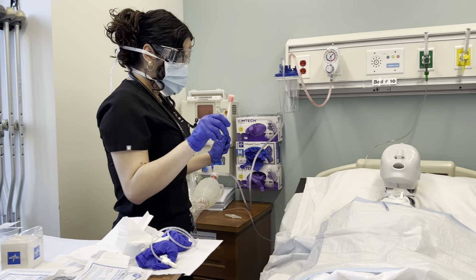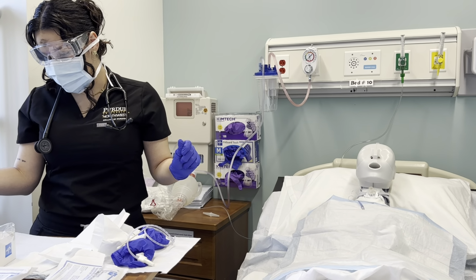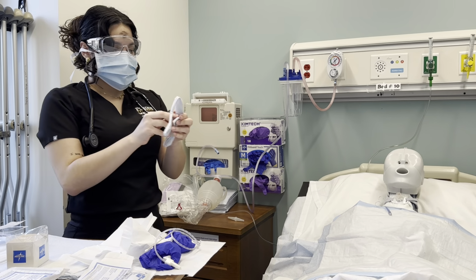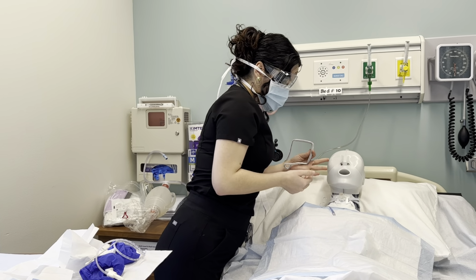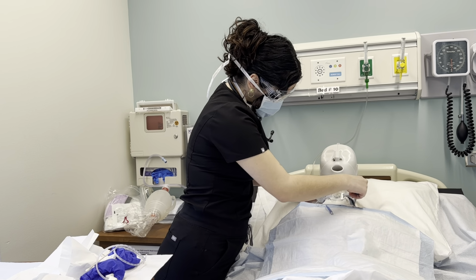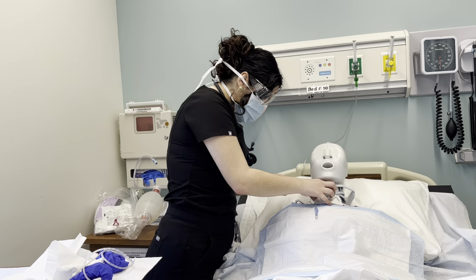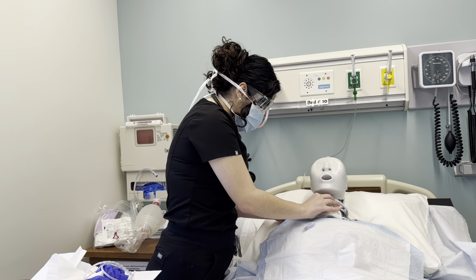Or perform oral hygiene. Dispose of my sterile gloves. I will grab the new brace, have my patient lift up his head slightly and place it behind my patient. I will remove the old straps at this time. And I'm going to be placing a waterproof pad. Place the new strap in.